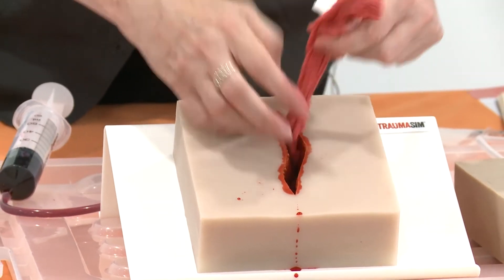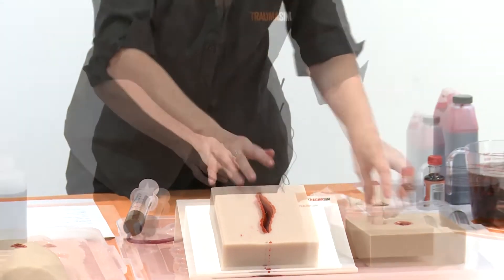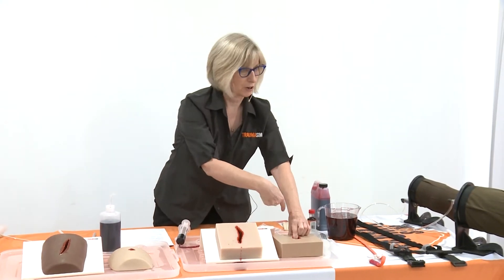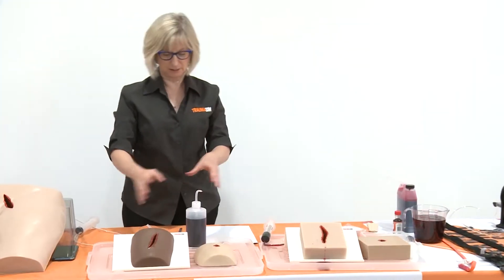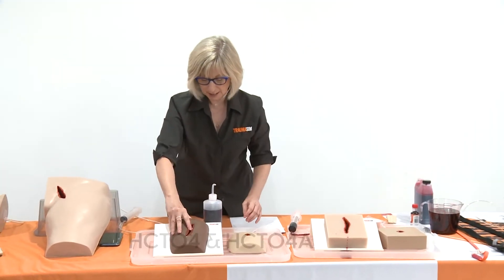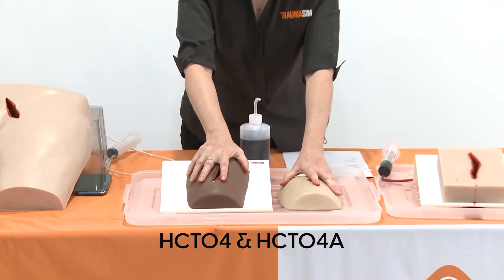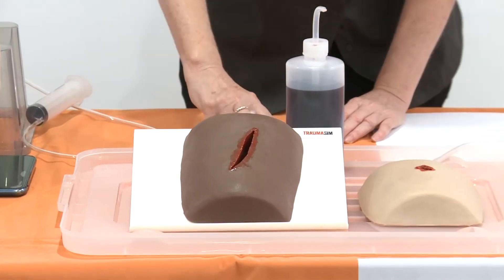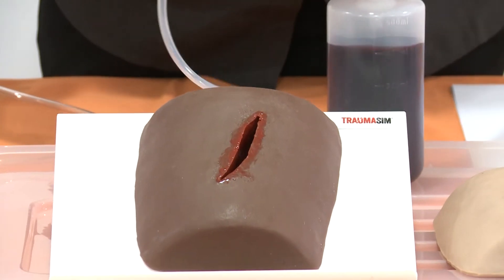That's the most basic one. The gunshot wound is the same process except you're going into a cavitation instead of just a small block. Stepping along to these ones here — again a laceration and a gunshot wound — these are just a little bit more human-shaped compared to the flat ones. Some people prefer it that way, some people don't care, it's really personal choice.